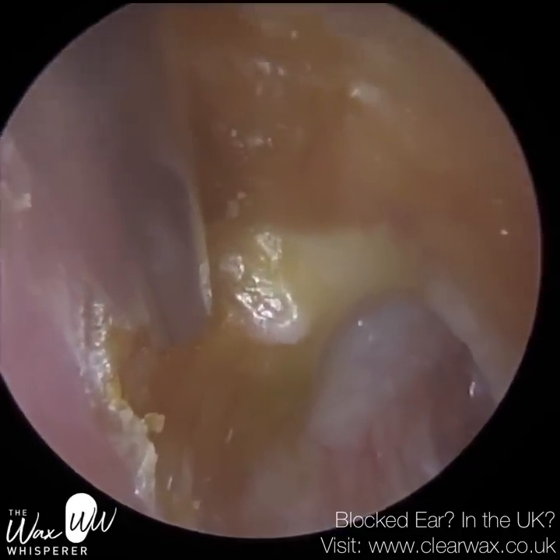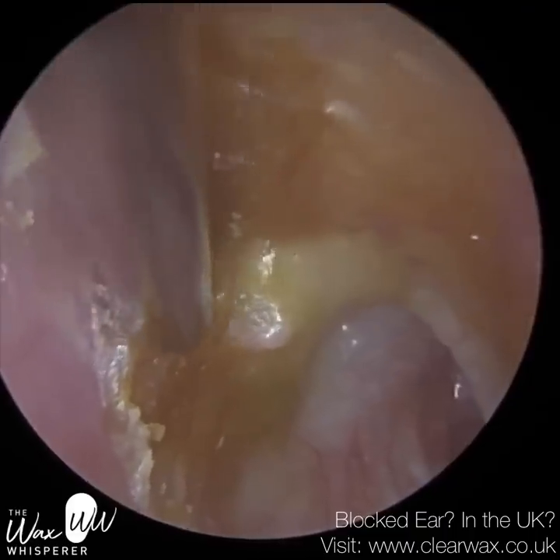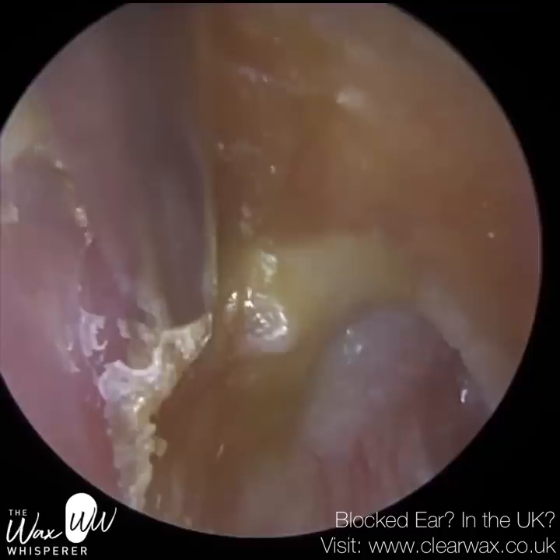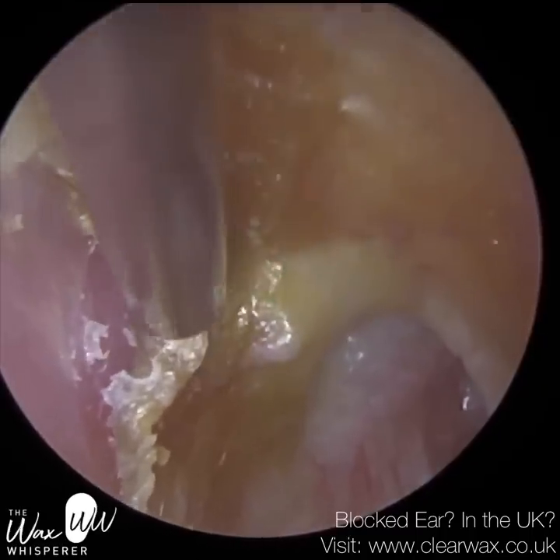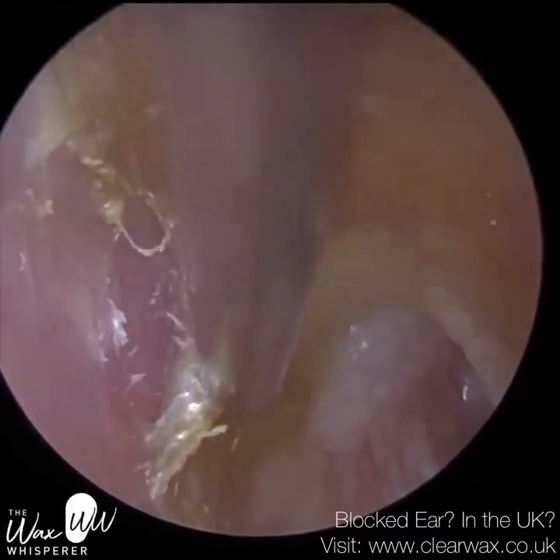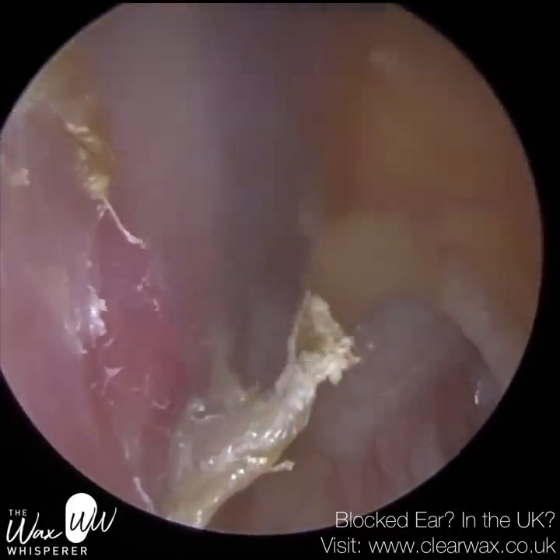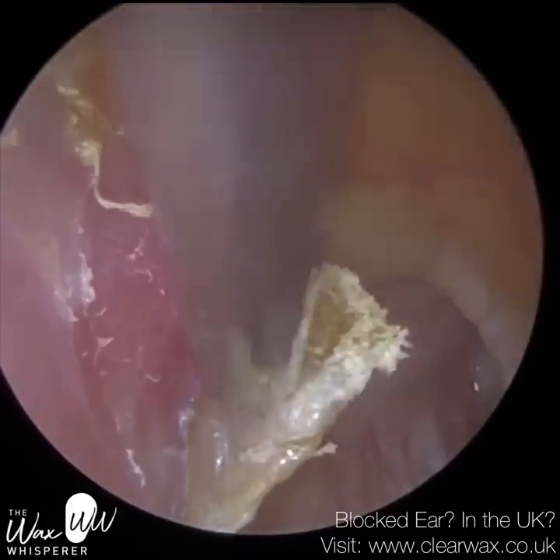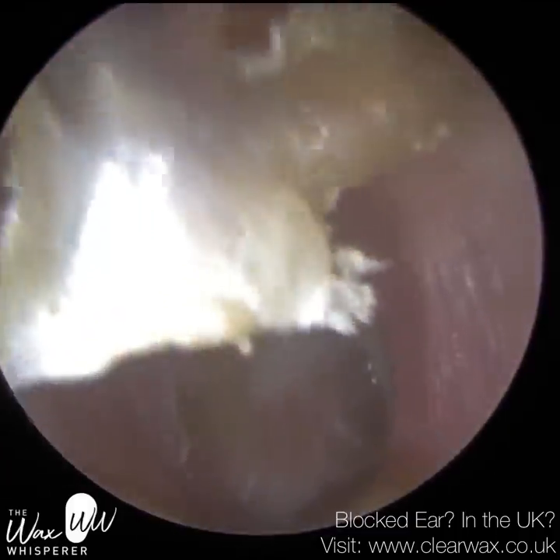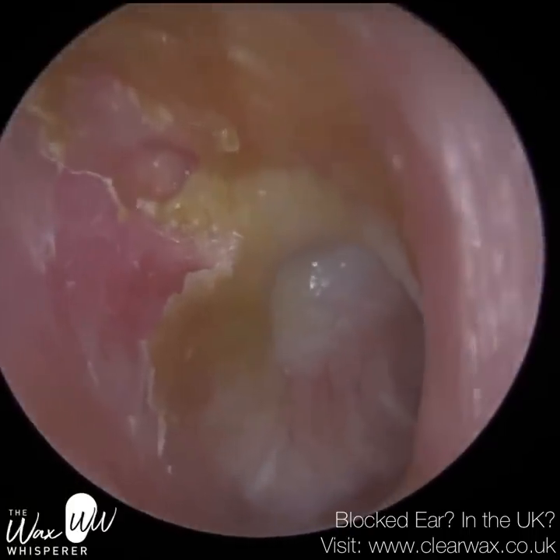This is patient two. In the center, you can see a white protruding landmark. Because I know this patient and have treated them before, that is actually the hammer bone protruding out — you're going to see it in more detail in a moment. I'm peeling away the skin. If I wasn't aware of that, it's plausible someone might go for that with the suction probe because it just looks like part of the skin — and that would have been incredibly painful. The short process of the malleus is protruding outwards because the eardrum is severely retracted in the posterior superior region, and also significantly anteriorly.